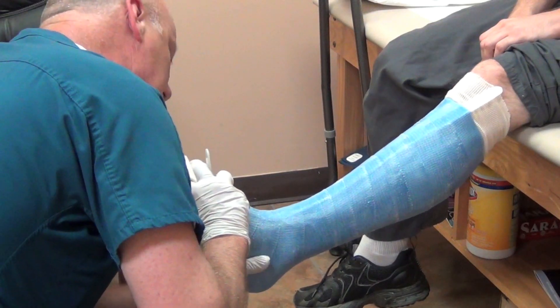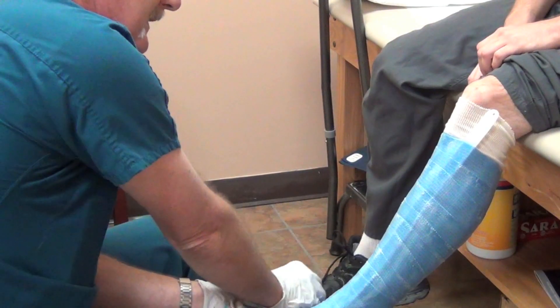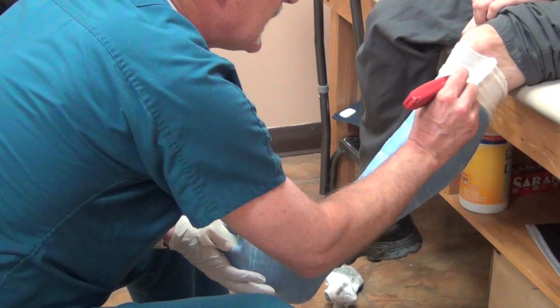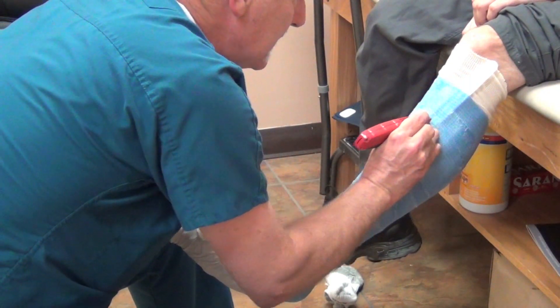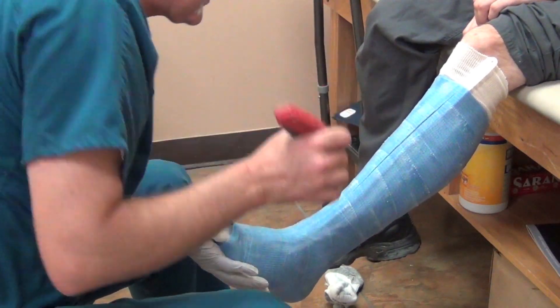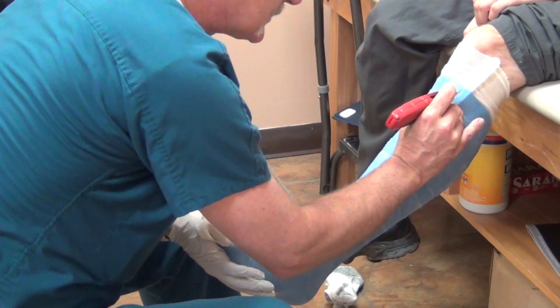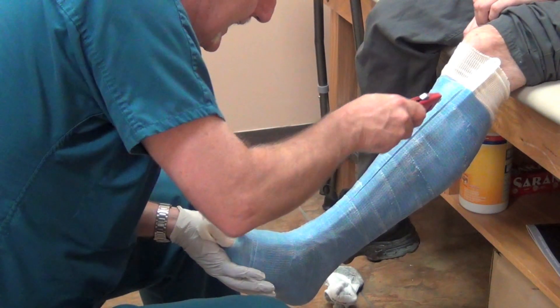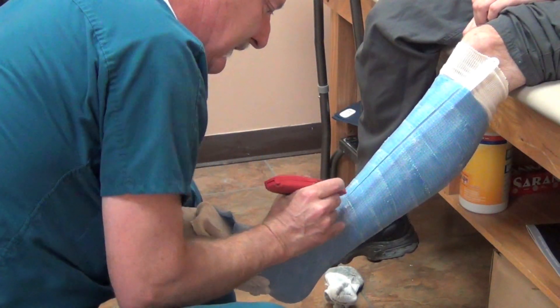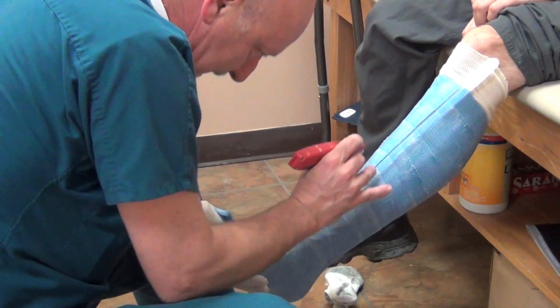I have a very well-defined heel and base of the fifth. Now it's ready to come off — you don't want to let this sit up all the way. Just run down your strip. I always keep one finger in contact with the cast; when you lose contact you can slide off. If you've got a finger guiding you, it's much easier to stay on line. As soon as you go off line a little bit, stop, go back and correct.